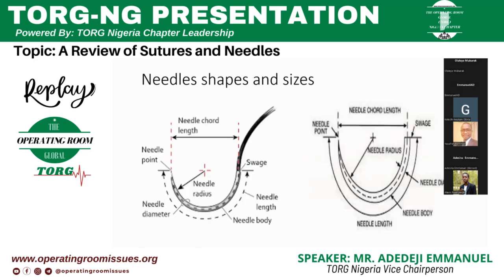Okay, so straight to the needles. The choice of needle depends on the kind of tissue. Of course, the needle is meant to penetrate the tissue of choice that is to be sutured. And of course, the strength of the needle and the length of the needle determine this.